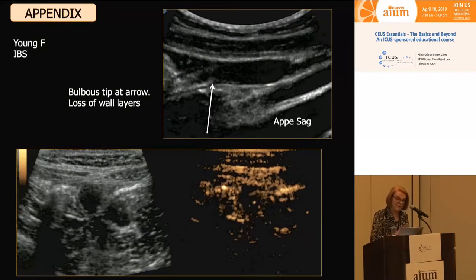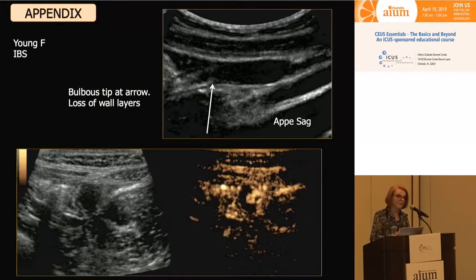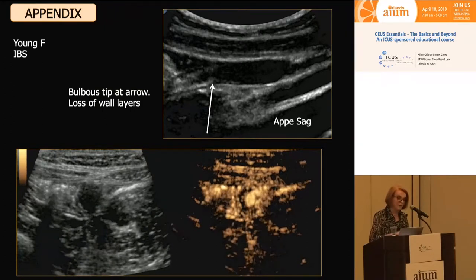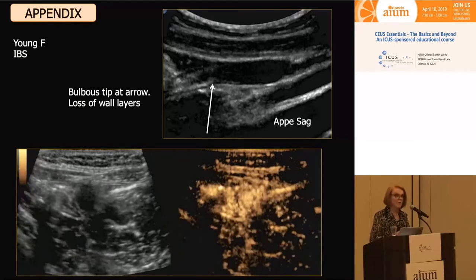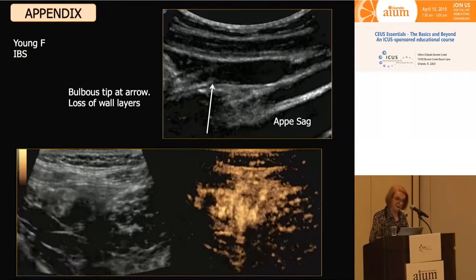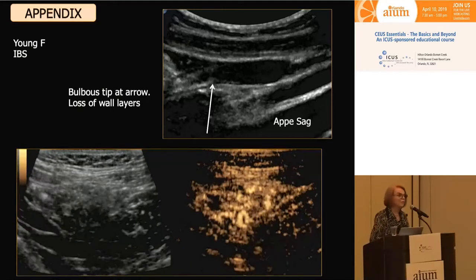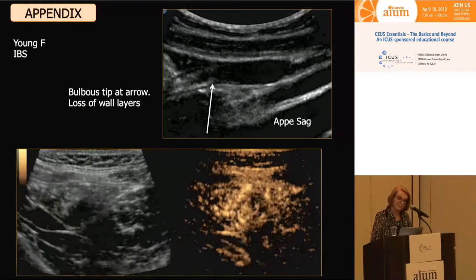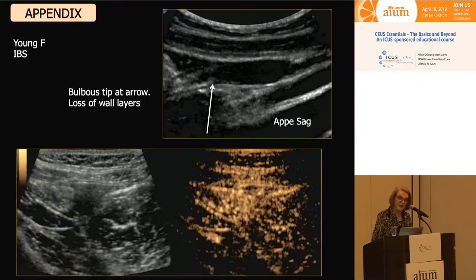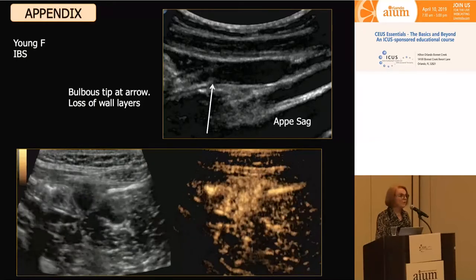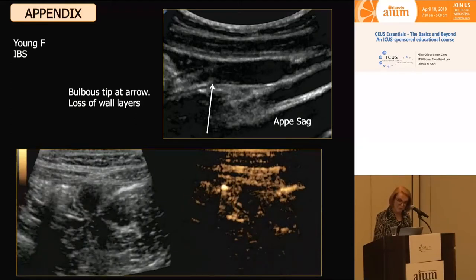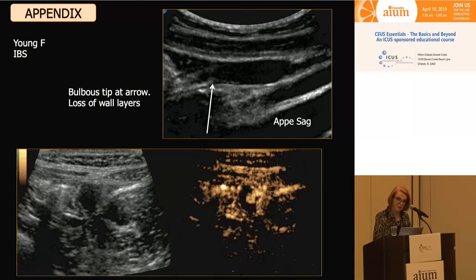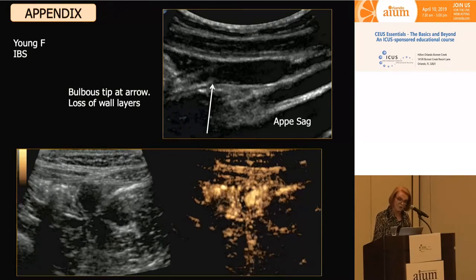This is a really fabulous case. One of my astute technologists was scanning a young female whose requisition said query irritable bowel syndrome. She said the bowel looks perfectly normal, but the appendix looks funny. She shows me the appendix with an arrow pointing to a transition point. You can see normal wall layers to the left of that arrow, while the tip of the appendix is quite featureless and bulbous — very black without retention of normal wall layers. We decided to do a contrast examination.